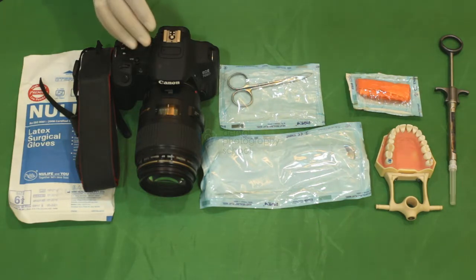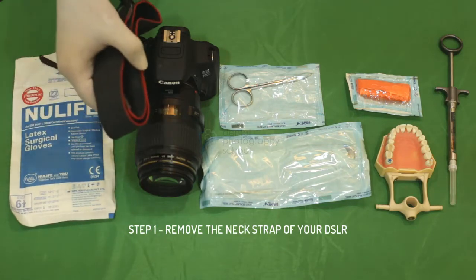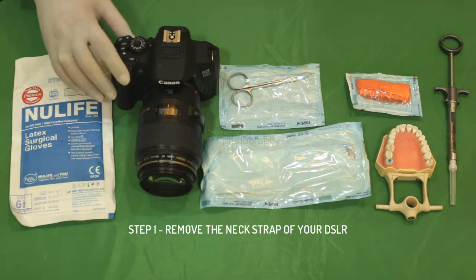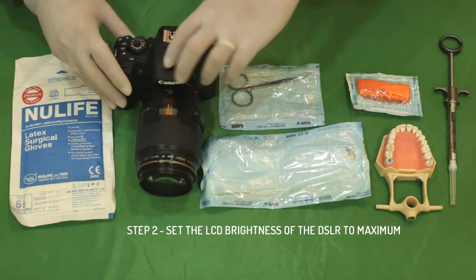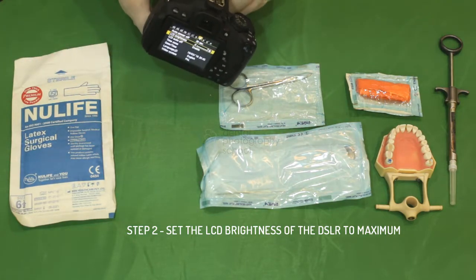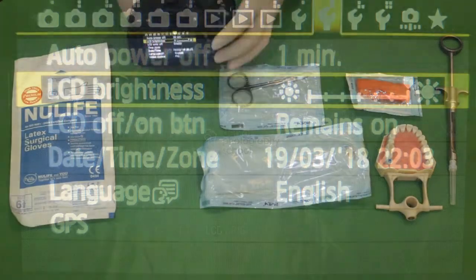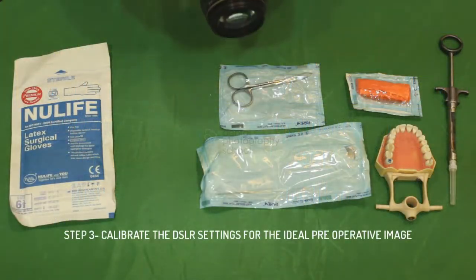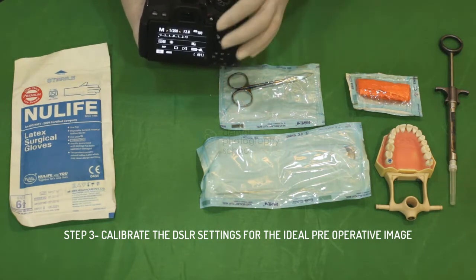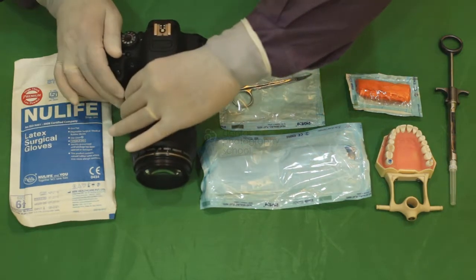You need to follow these simple steps. Step number one: remove the strap of your DSLR, as we have already done. Step number two: increase the brightness of your DSLR to the maximum, as we have already done. Step number three: achieve the ideal settings for documentation, as we have already done — but we shall show it to you once again.